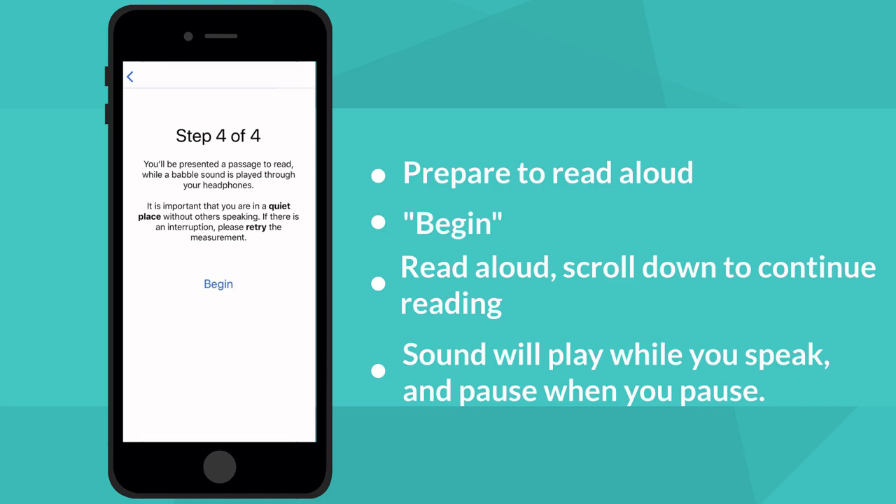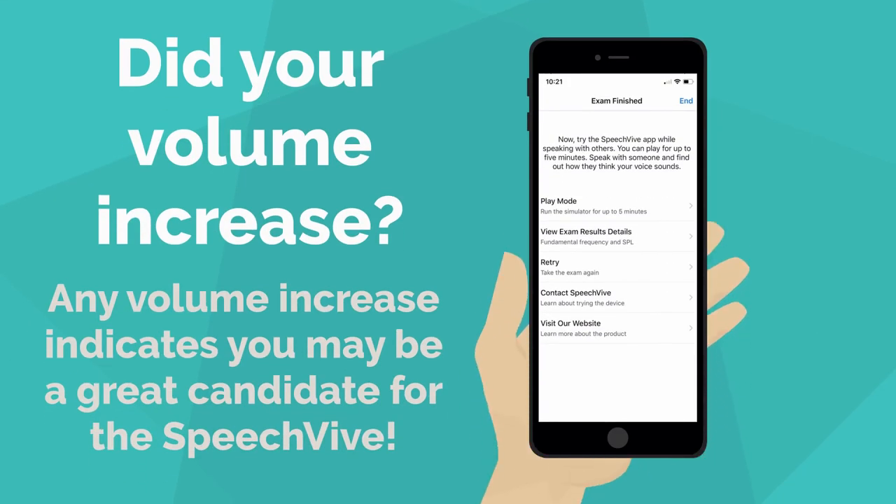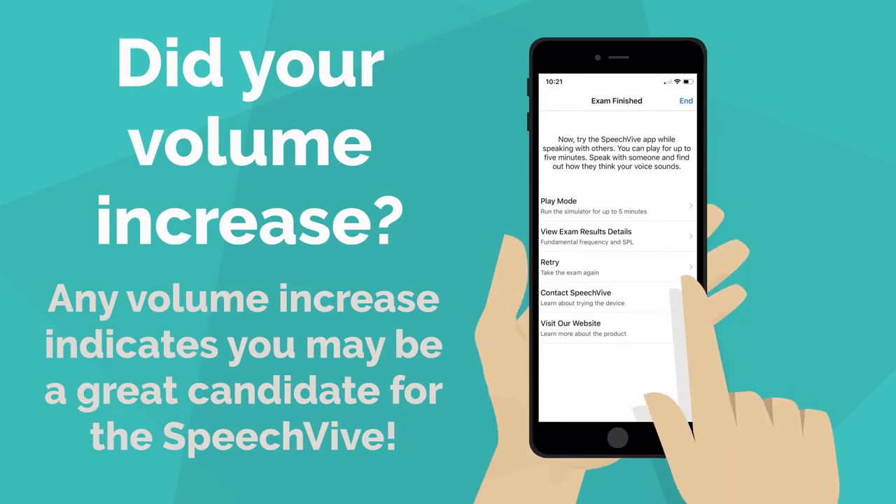For the final task, you'll be reading aloud again. This time, when you speak, you will hear sound in your ear. This is the SpeechFive app attempting to increase your speaking volume while you read. When you've completed the task, you will see your results.